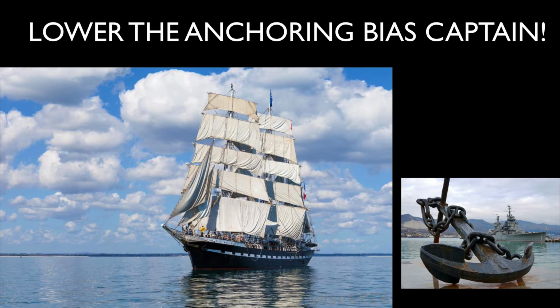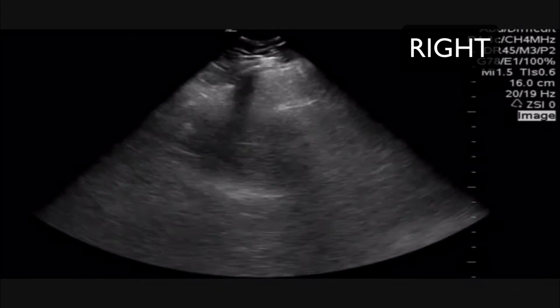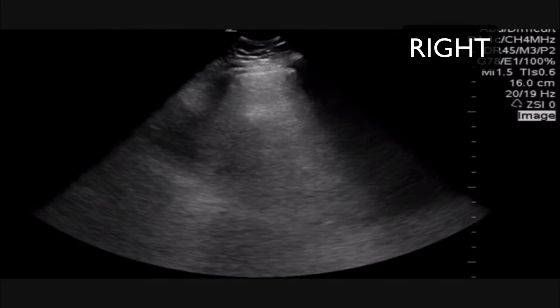Now, we think she has a heart issue based on what the husband said. She's got some crackles in her lungs, and there's no real big JVD or peripheral edema, but thinking more like heart failure right now. Get an EKG, and it's not exactly normal, but nothing on it really explains her overall presentation. So since I want to figure this out right away, I put the ultrasound on.